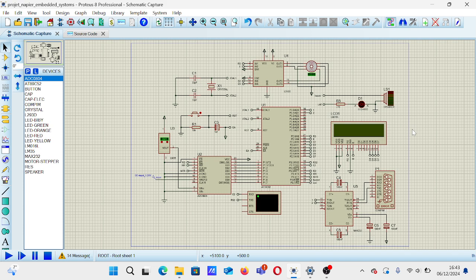This is accomplished in the design through two objects. The first one is the LED and the second one is the buzzer, as you can see. The LED is red because it is the most appropriate method for visually alerting that the temperature has been exceeded. Its bright and universally recognized warning color ensures immediate attention. The buzzer, on the other hand, has been included in the circuit to assist visually impaired or blind individuals by providing an audible alert to signal the problem.